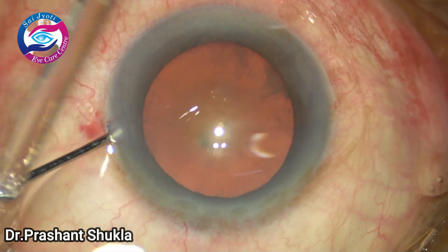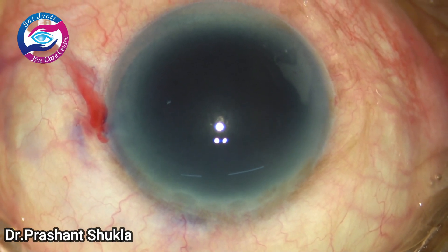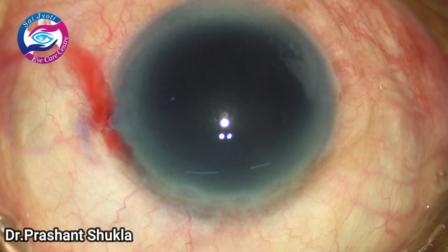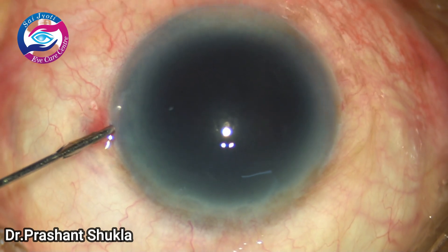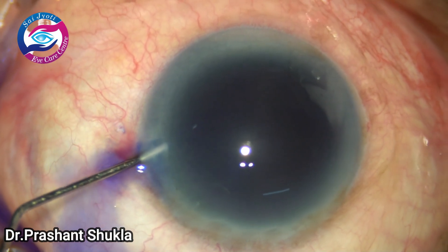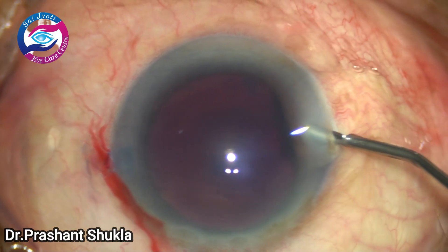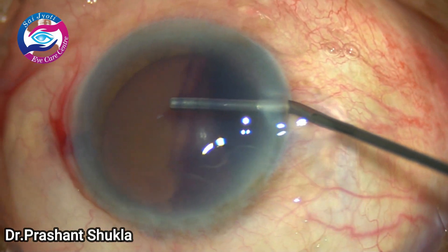We begin by staining the anterior lens capsule using trypan blue dye. This is a 65-year-old female patient with diabetic brunescent cataract; she is also obese and one can see head movement with every breath. The patient has been blocked with peribulbar anesthesia and the trypan blue dye has been washed out using BSS. The anterior chamber has now been filled with 2% HPMC.